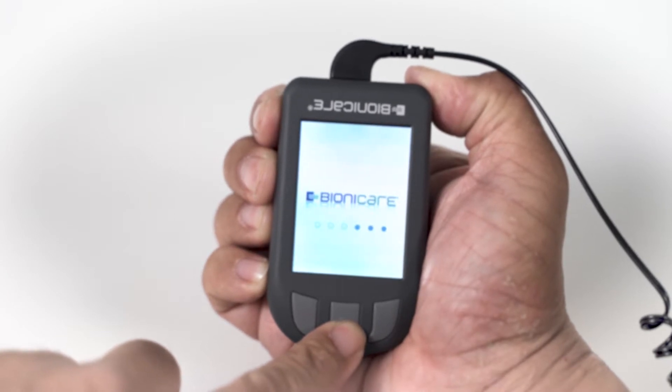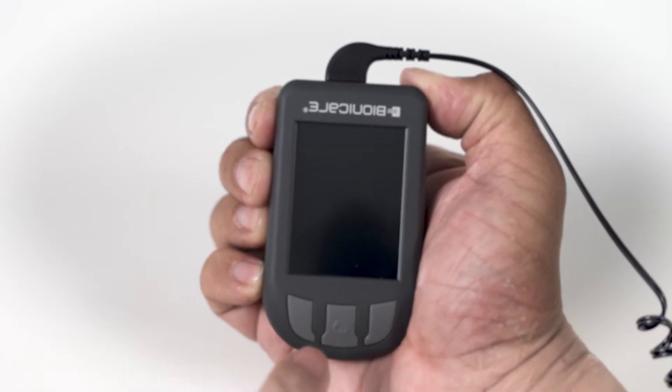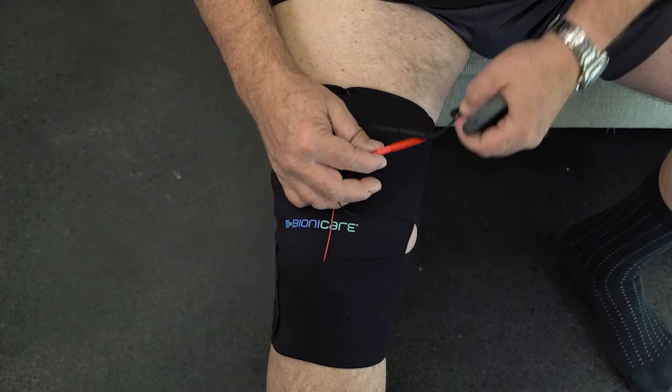When finished with your treatment, turn the device off by pressing the middle button and holding until the device shuts off.